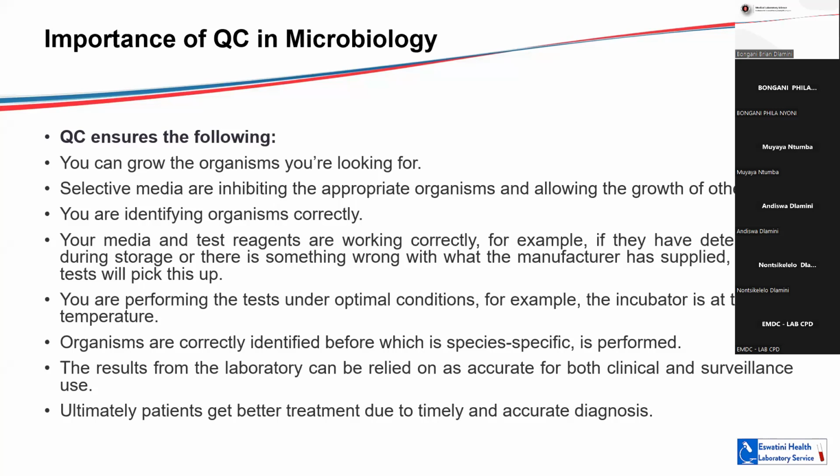QCs, you will ensure that you're identifying your organisms correctly. It also ensures that your media and test reagents are working correctly. For example, if they have deteriorated during storage, or if there's something wrong with what the manufacturer had supplied, the QC test will pick this up. It will also ensure that you are performing the test under optimal conditions. For example, your incubator is at the right temperature.